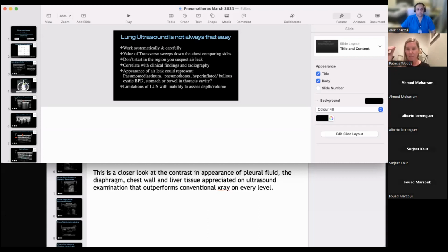It can rub away. So I think you can use it really for diagnosis. Get a pen if you need to. And I know some of the early studies, I think Cattarossi and colleagues, talked about if the lung point reached the anterior axillary line in a baby lying supine, it became more important then. It might have just spread. It might be microns of separation, but it's gone across the chest.